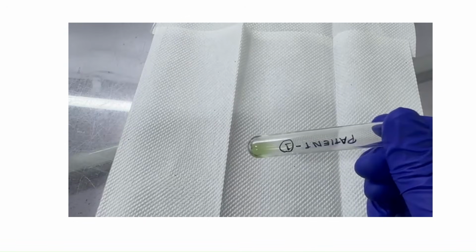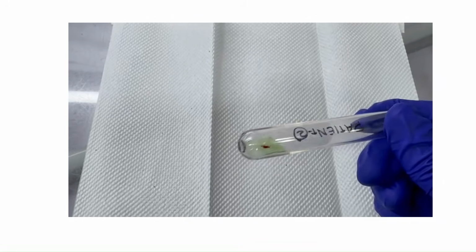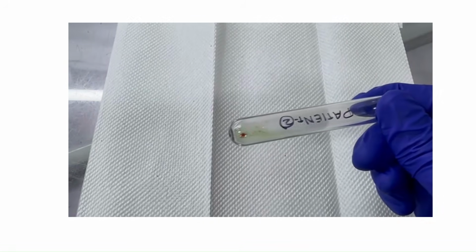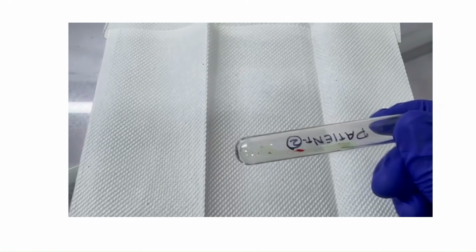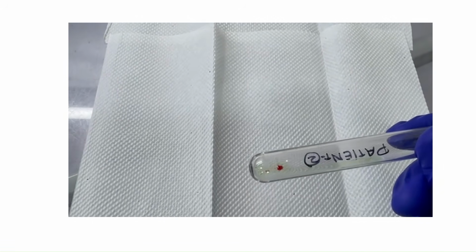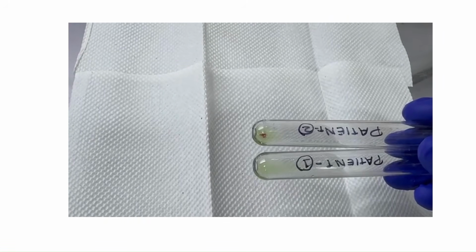Here we can see for patient 1 there is no agglutination reaction at all. For patient 2 here we can see there is 4+ agglutination reaction. So by tube technique also, patient 1 has a negative DAT and for patient 2 the DAT is 4+ positive.